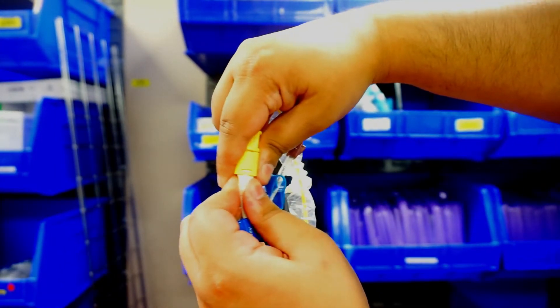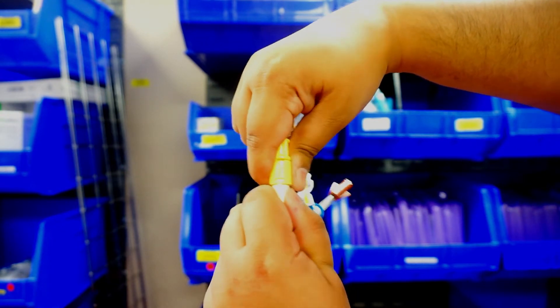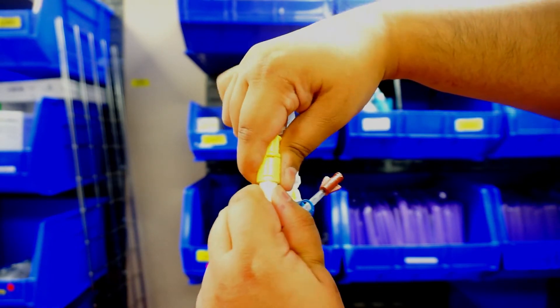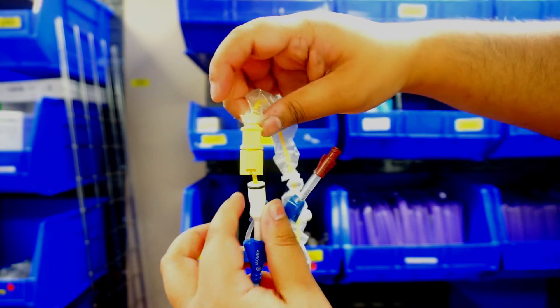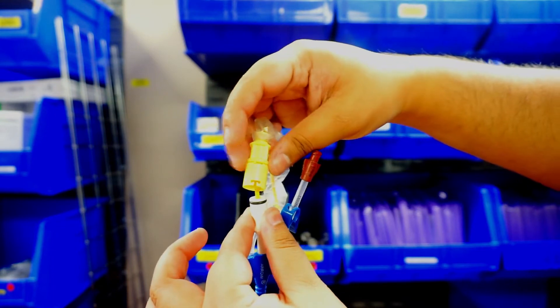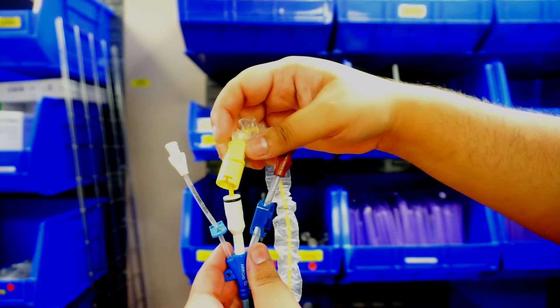And at that point, then I can pull my Swan out a little bit. You want to make sure, when this is actually in a patient, this is going to be a little uncomfortable for them. But you're just going to pull the Swan out a little bit. Now you're able to pull this entire thing out.